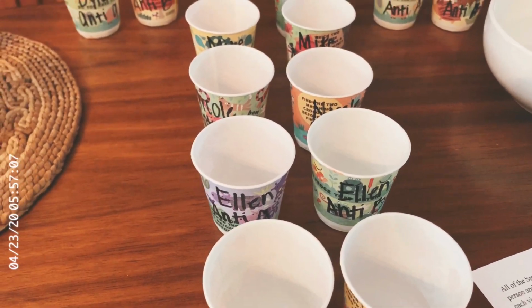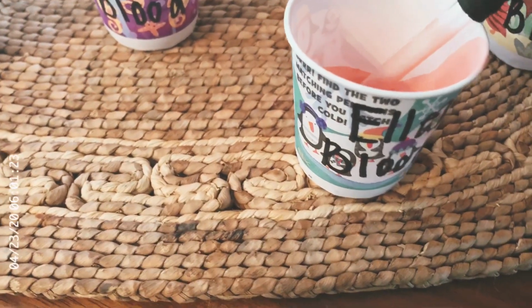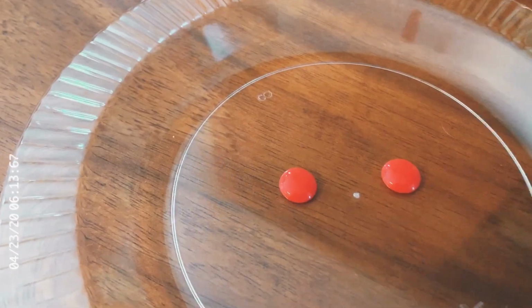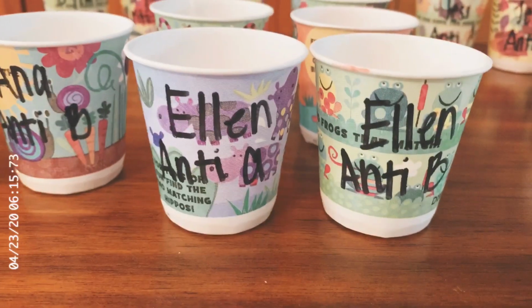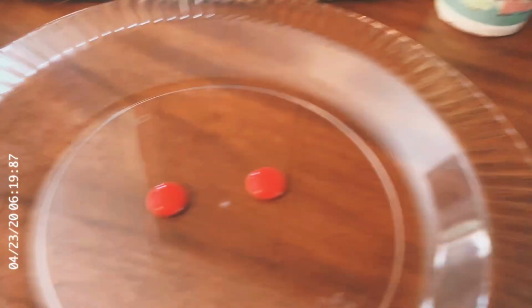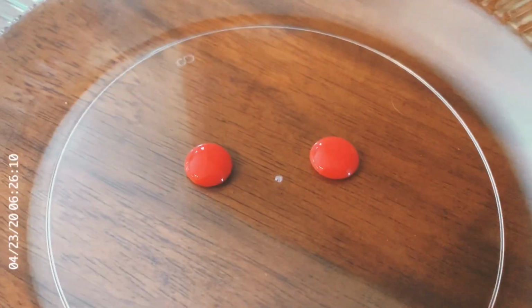So let's get started. All right, I'm gonna start with Ellen's blood. I'm gonna go ahead and get a sample of Ellen's blood. I'm gonna put 2 drops on our sample plate. So we have Ellen's blood right there, and now we're gonna test it with both of Ellen's anti-serums. So there's anti-serum A and anti-serum B, and I'm gonna put one in one and one in the other. I'm gonna do A on the left and B on the right.